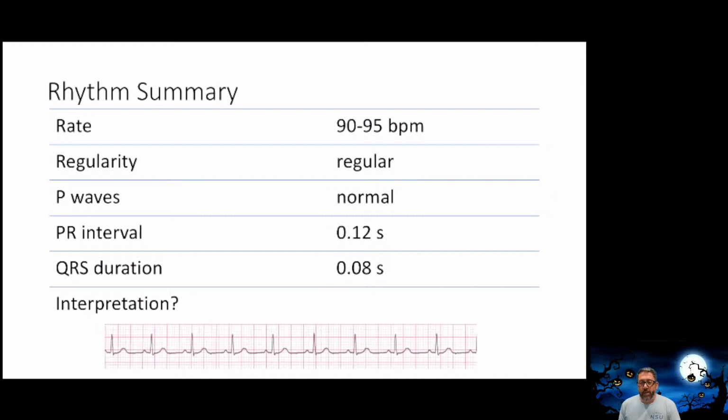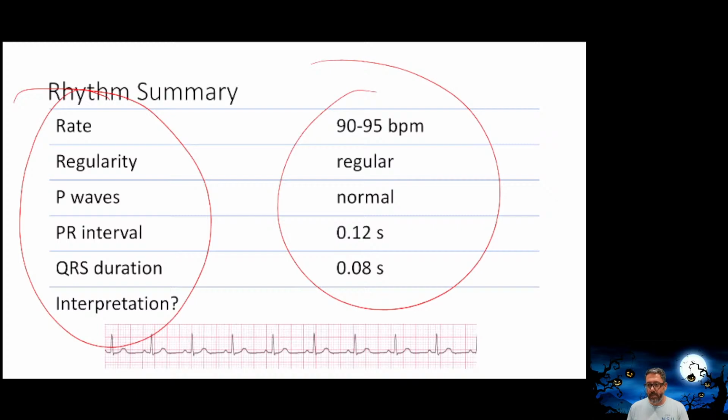I'll get to the left and right bundle branches very, very soon, Maniba, I won't forget. I just wanted to finish this part. So when you're looking at an EKG, these are all the different things it could be. Every single rhythm that you've learned about is only going to have one combination of these things. If everything is regular, the only thing it could be is normal sinus rhythm. If everything is regular, but the heart rate is over 100, sinus tach. If everything is great, but we have an irregular rhythm, then you get into your AFibs and so forth.